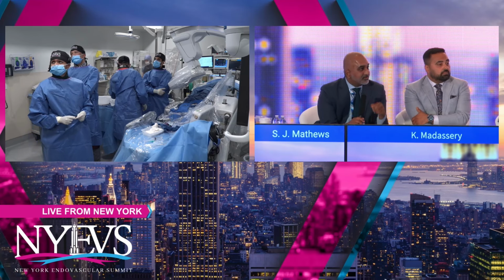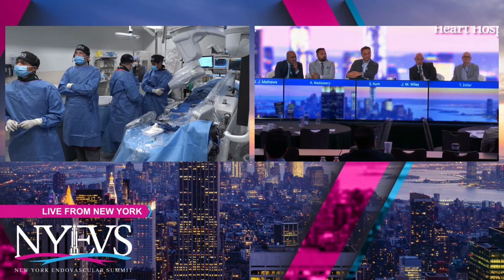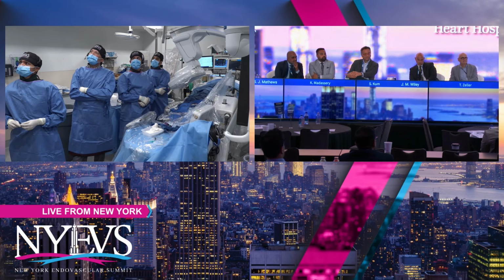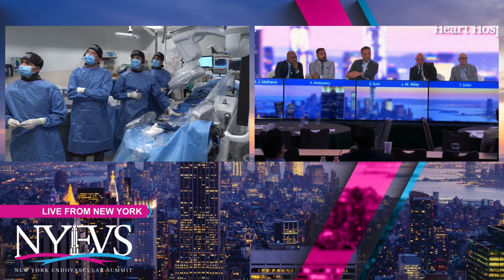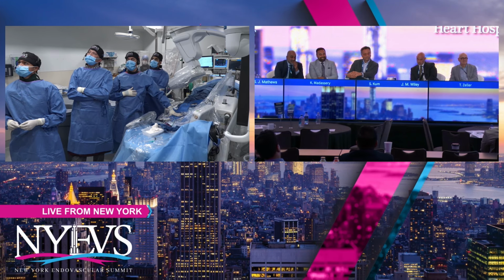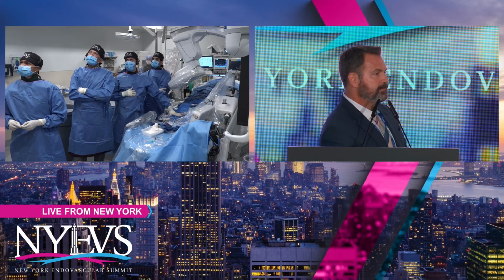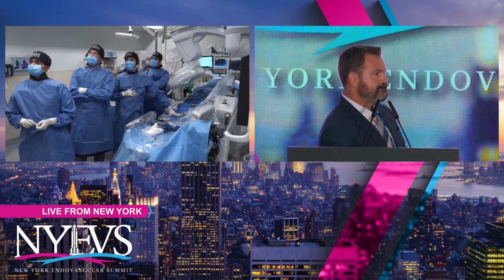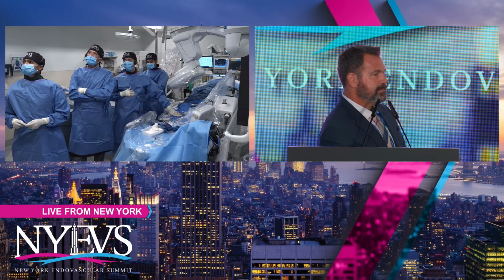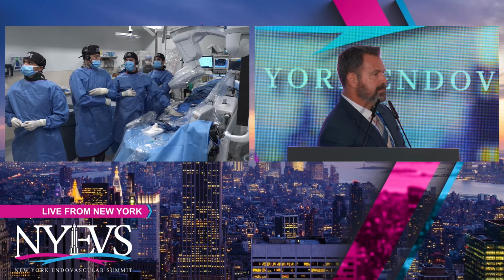So I have a question just for the panel, because I think it's a great case. They've done a Rotarex and this DCB. What's your next step when this fails? Well, I think you have to entertain the thought of bypass at some point. So what's your algorithm? How many ISR failures do you have in your mind that you say, okay, after one or two, or is it two or three, or three or four, or never?